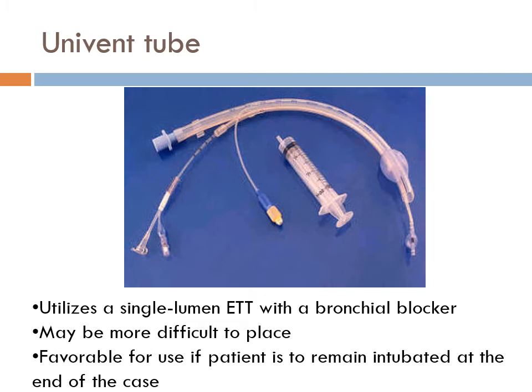Bronchial blockers are great because at the end of the case, I have a single lumen tube in. I just pretty much drop the balloons and take this out. Notice I lost my little piece here. These pieces are always loose, so put those on really tight on any case you do.